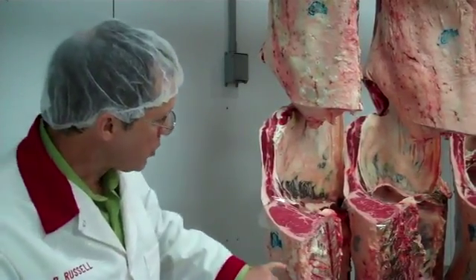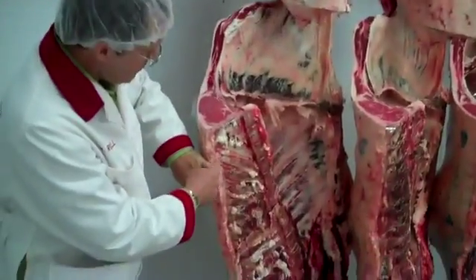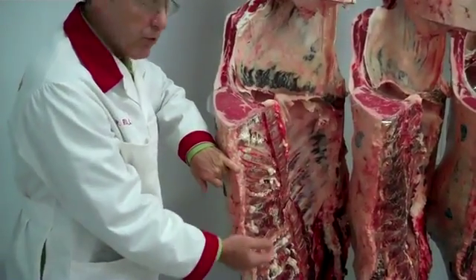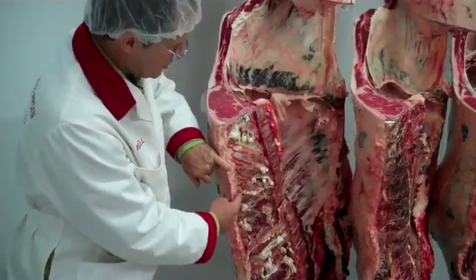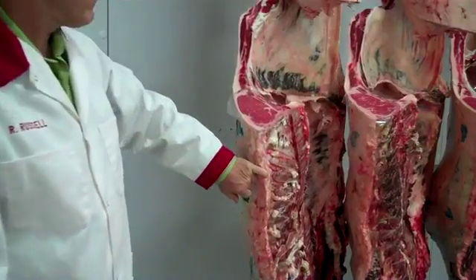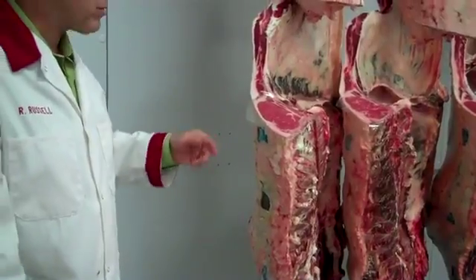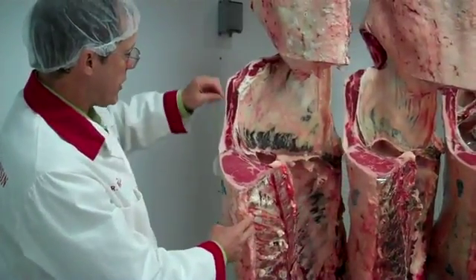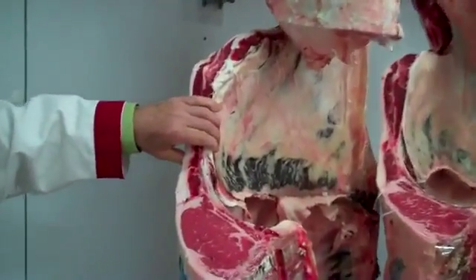But for quality, we'll look at the maturity of the carcass. We'll look again at these cartilage tips. And just to do a verification that the animal originated from a young, youthful animal that should deliver quality product. And usually in our youth project livestock, these are all just fine. They're all young animals. That's already been verified. After that, we'll look at the lean color, because lean color contributes to our assessment of quality grade and maturity of the animal. And then we'll finally go ahead and we'll look at the amount of marbling.